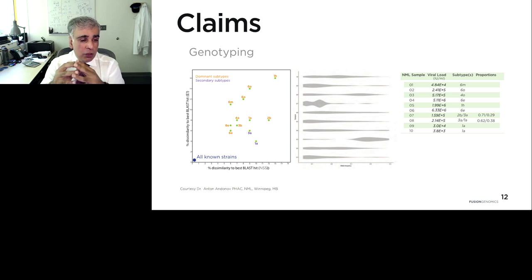We don't really call them patients here; these are the RNA samples, which have the RNA belonging to hepatitis C. Now, if you focus on the green dot, which is labeled as 1H, what you see there is an infection.